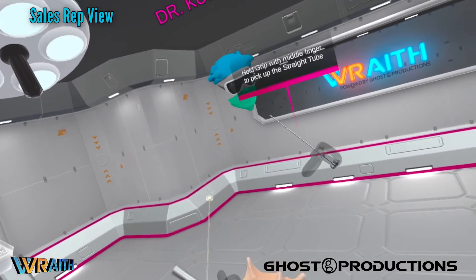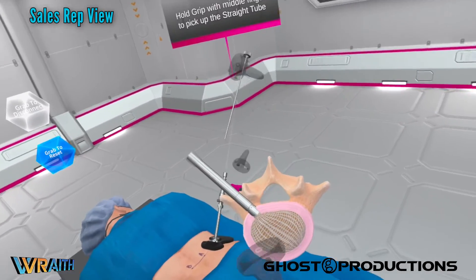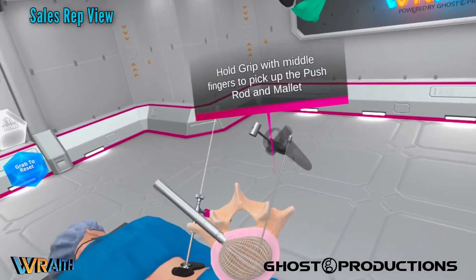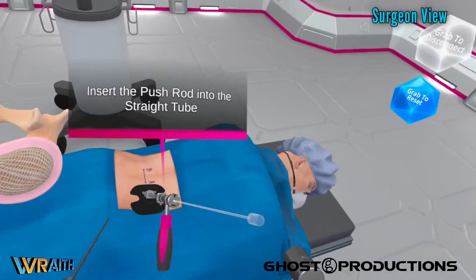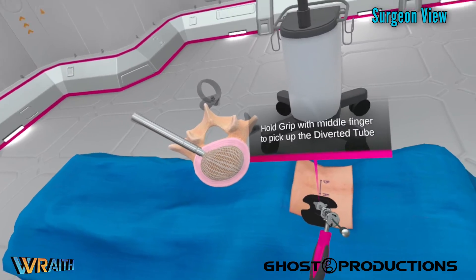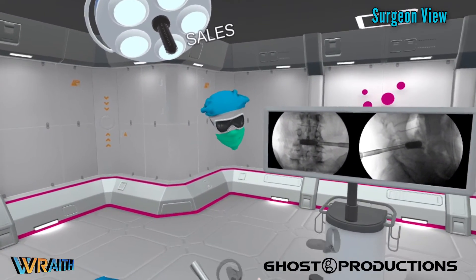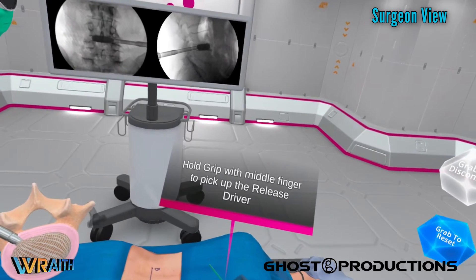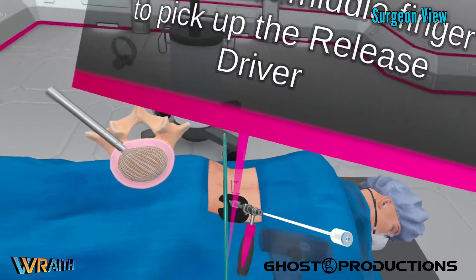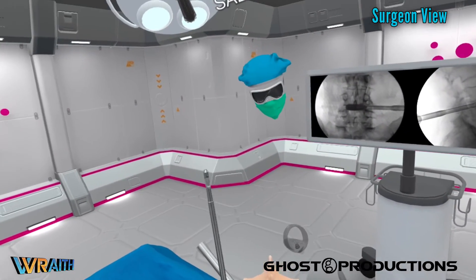Then we'll finish with the straight tube — it's a little shorter and fills the channel left behind by the diverted tube, because the diverted tube is put into the center of the OptiMesh container. This will just fill the little channel left over. It's just going to pack in the end so when you tie this closed, it's fully packed. That usually takes less than an entire tube of bone graft, but there's enough in any case. This is our release driver — this will disengage the OptiMesh implant from the inserter and leave the mesh graft container in place for fusion.